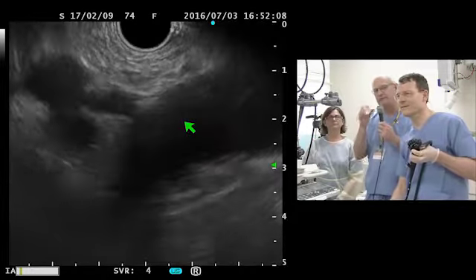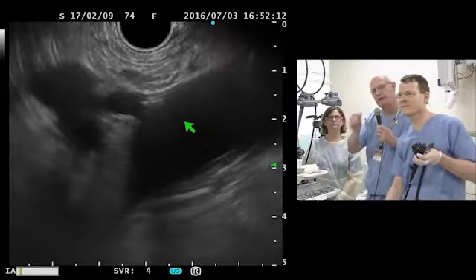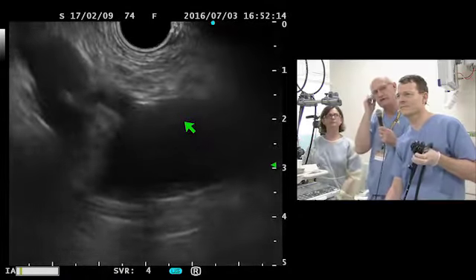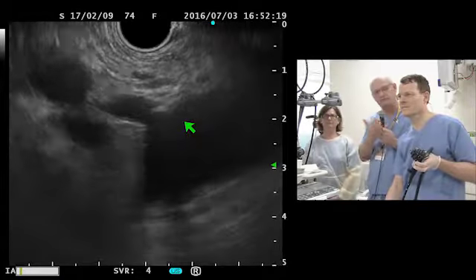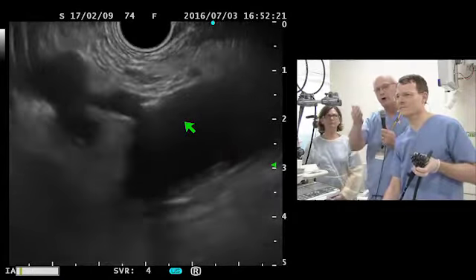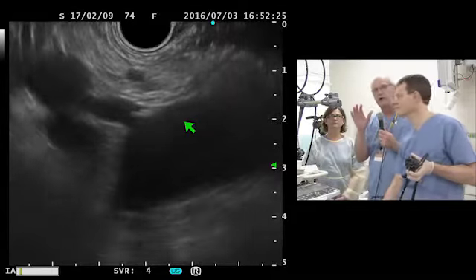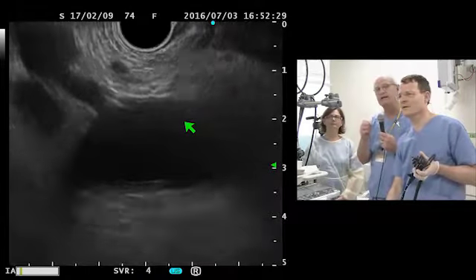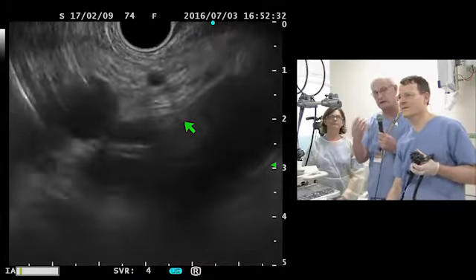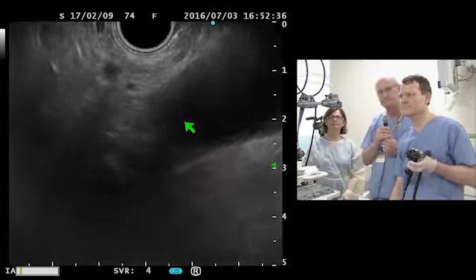Sometimes there isn't just mucin exuding from the opening, but if it's patulous, sometimes you can milk some mucus out of it, which Stefan tried to do off camera. In my own opinion, although the papilla is not pathognomonic for IPMN, it's certainly consistent with it. There's no tumor, but there's a patulous opening.